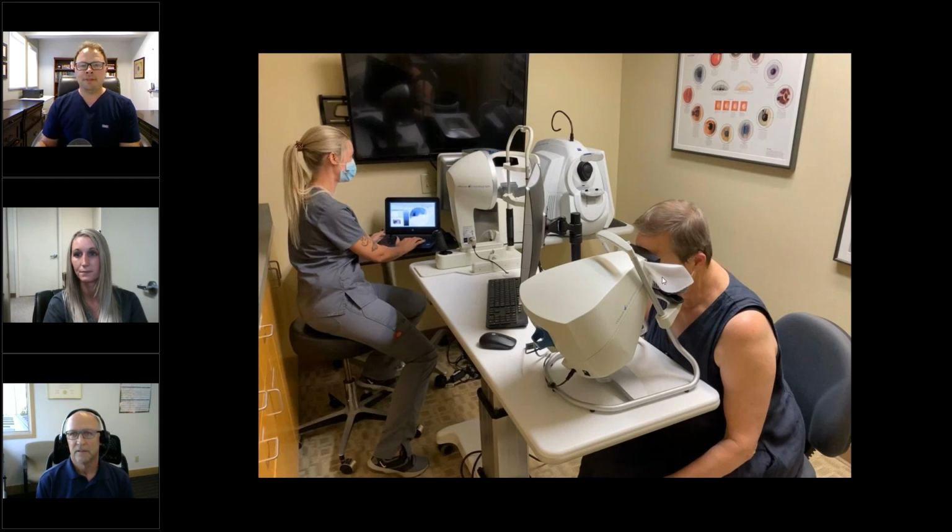Yeah, that's a side benefit we didn't really even anticipate. We're booking out a ways, and every appointment is crucial at this point. In clinic earlier today, I did an on-demand perimetry and was able to not have to bring the patient back. In those cases, when it works out that they don't have to come back, it's definitely a benefit. In many cases, they still need to come back at 1 month, but at least it's done with more thoughtfulness on our part and more information on their part.